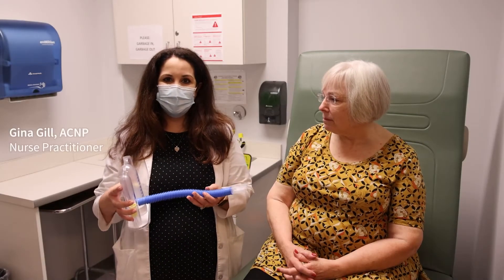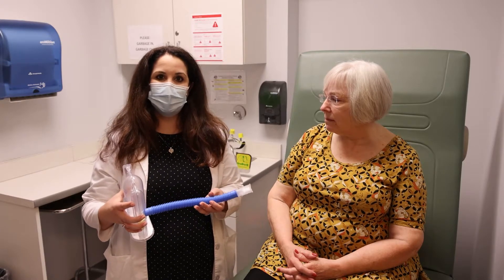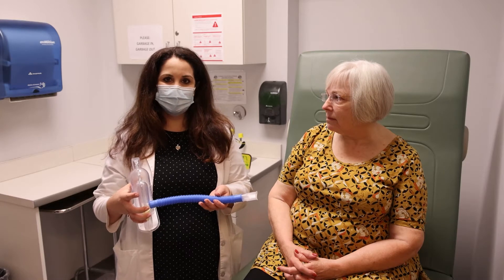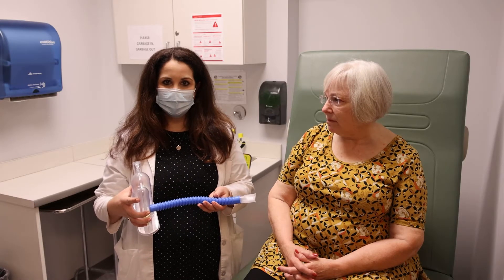Hi, I'm Gina and I'm here today to show you how to use an incentive spirometer. After surgery, you'll be given an incentive spirometer to help increase oxygen flow, reduce pain, and prevent the risk of pneumonia. The same breathing exercises can be done before surgery to help strengthen your lung function.